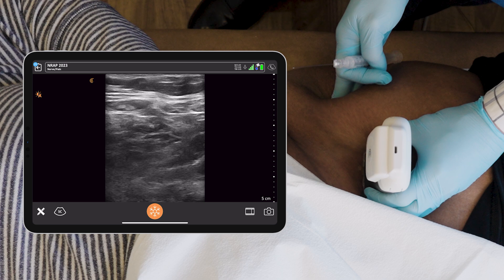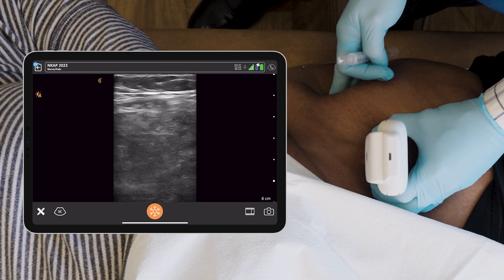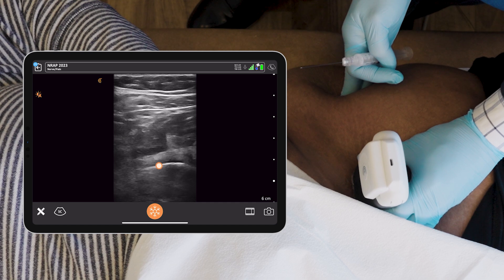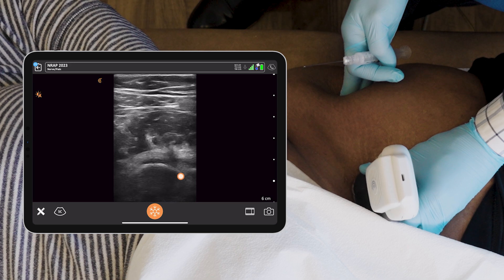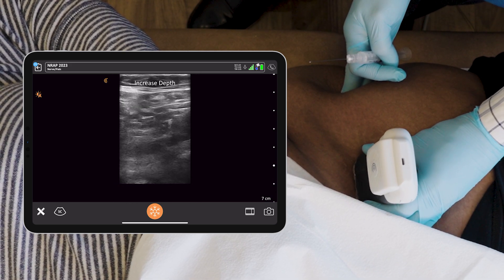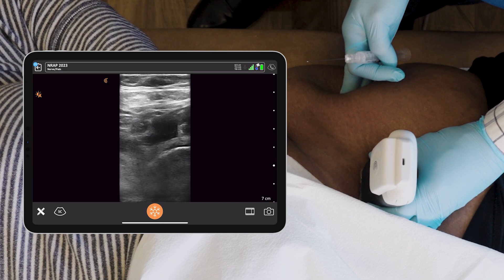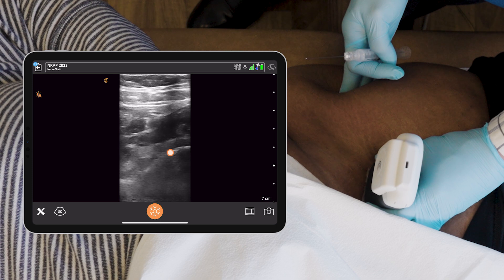So I'm going to look for her hip joint. Here we found the head of her femur, and the labrum is medial to that right over here. And I'm going to find the neck of the femur. We see the neck of the femur, which is like a valley, and the head of the femur, which is like a hill. Trying to get them both aligned in the same view and the same plane — and I found it.